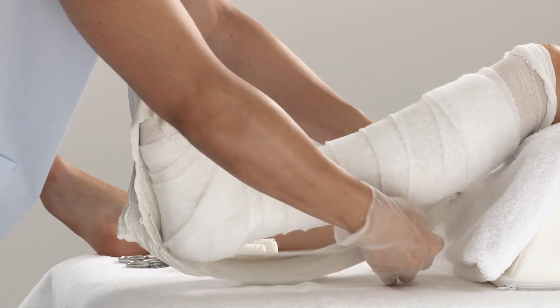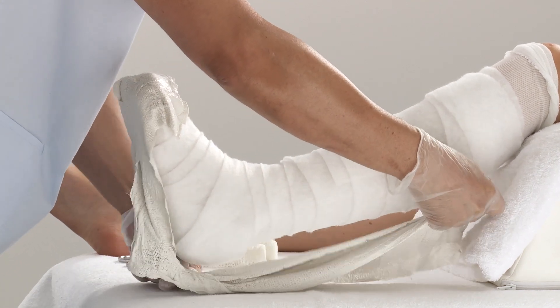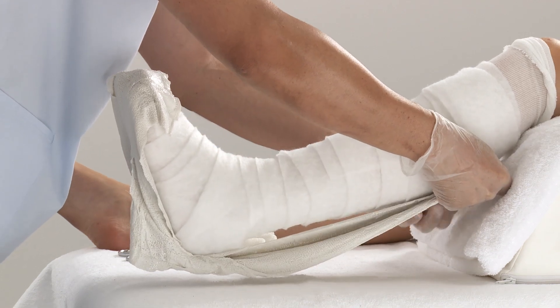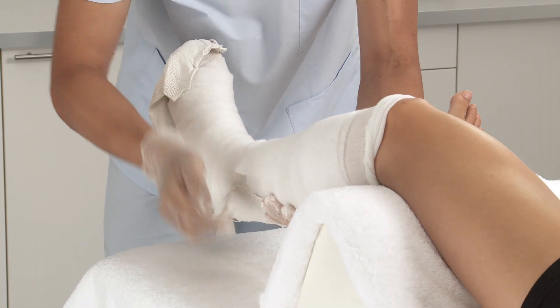Apply onto the patient's lower leg by folding some of the splint over the toes, placing it along the sole of the foot and the calf. Smooth and mold the splint down.